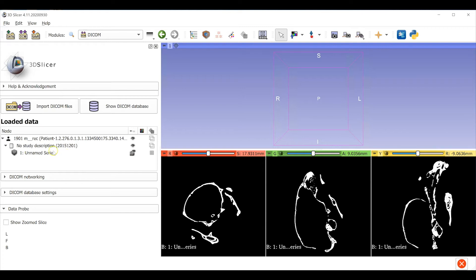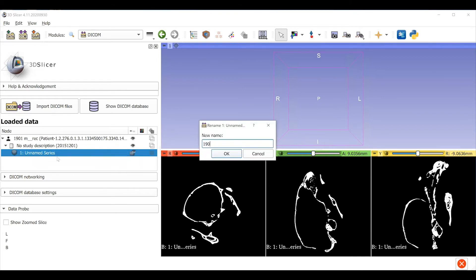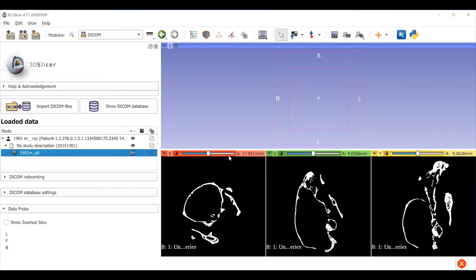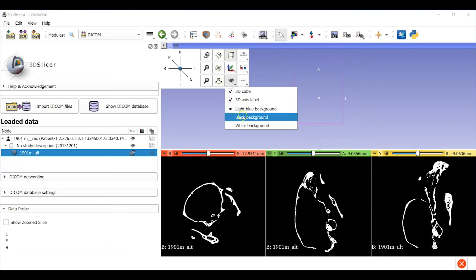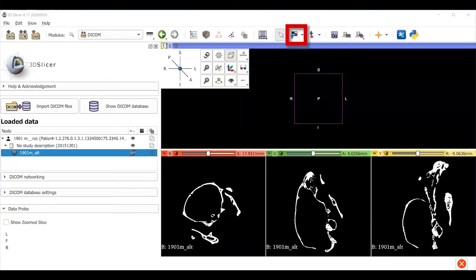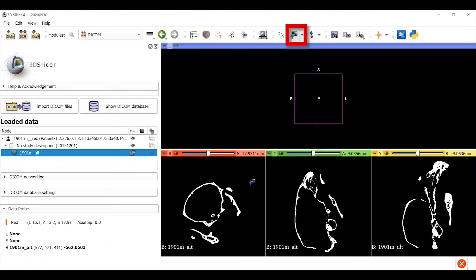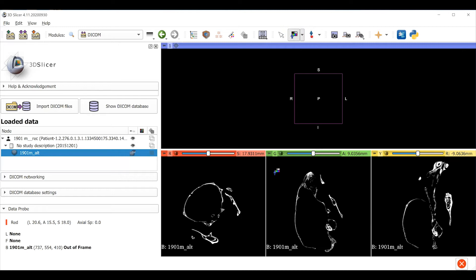And we'll quickly go through all the same steps to set up the workspace. I'll rename the image volume for the specimen and I'm adding alt here to distinguish it from the first volume. I use the 3D viewer menu to change the background to black and switch from perspective view to orthogonal view. And then I'll use the grayscale tool to adjust the brightness and contrast in my 2D slice windows.